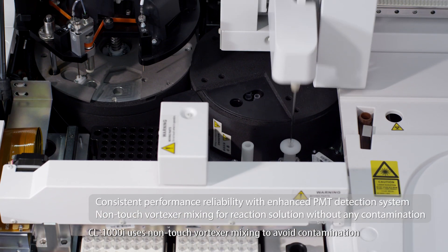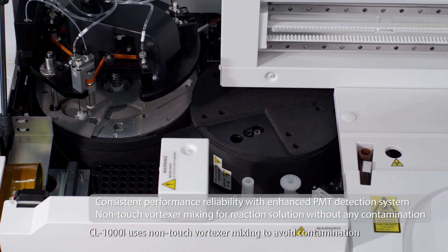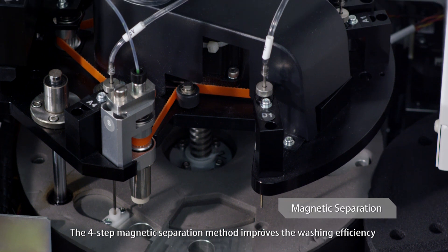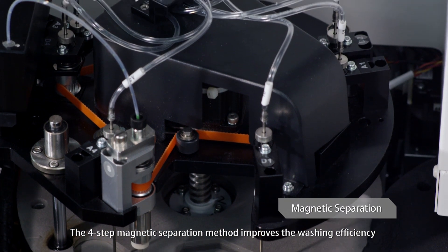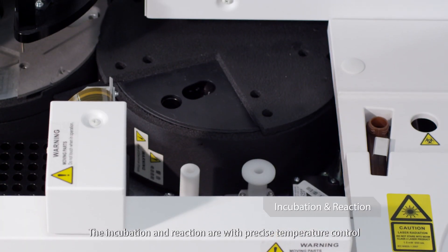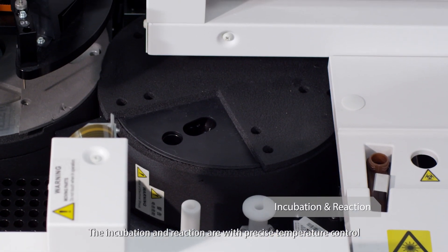CL1000i uses non-touch vortexer mixing to avoid contamination. The four-step magnetic separation method improves the washing efficiency and reduces interference. The incubation and reaction are with precise temperature control.